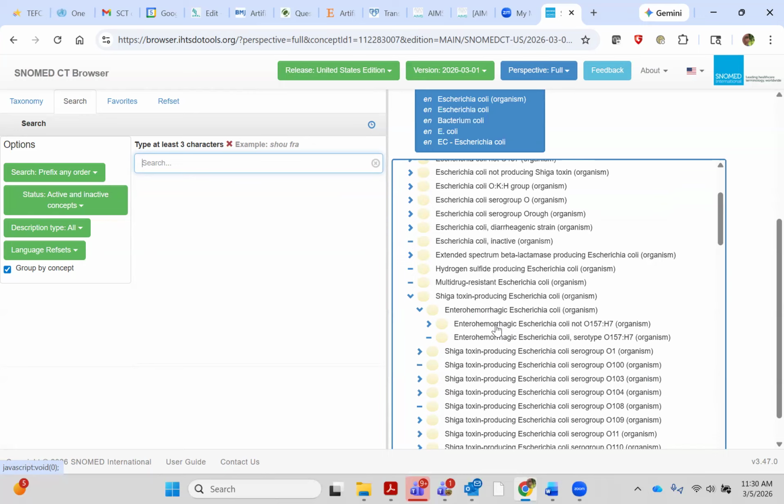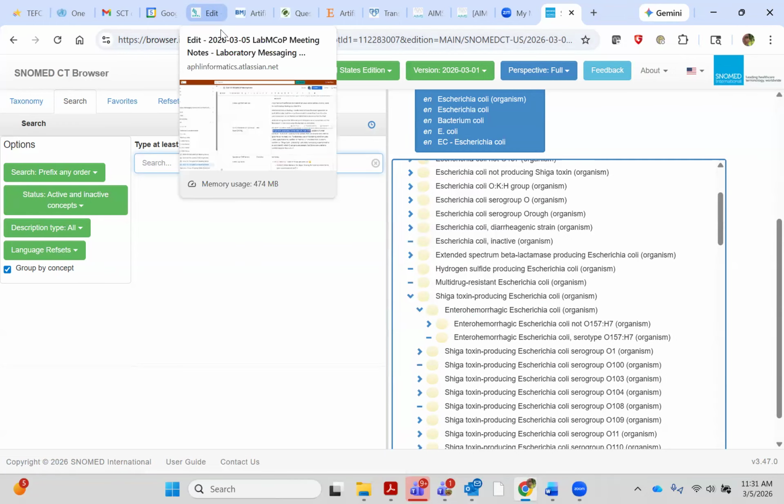This is a good example, though, where you have different combinations of positive, negative lab tests that are part of the organism identification, no matter what the organism is. Obviously not all of them require this. And then how it plays into how it's finally recorded and encoded.